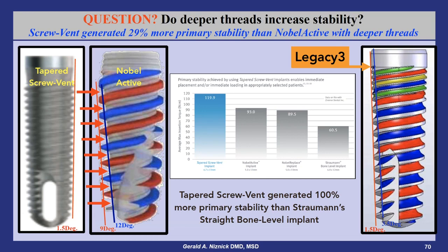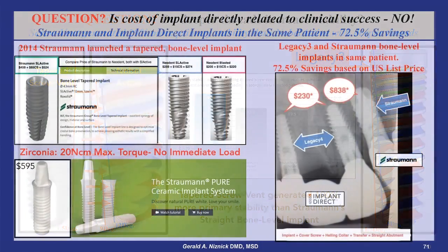I am no fan of the use of osseodensification drills that run backwards, supposedly compressing the bone as it pushes it laterally. Osseodensification occurs naturally by inserting a tapered implant self-tapping into an undersized socket, and the compacted bone is between the threads where it can do the most good in increasing stability.